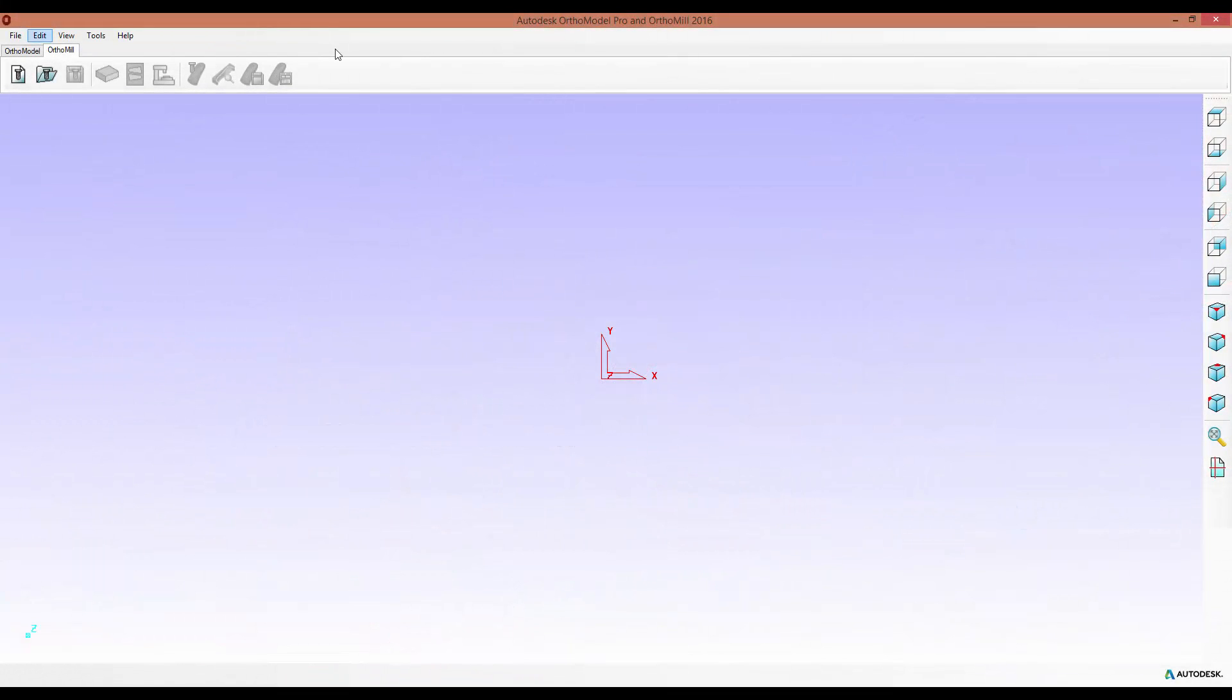Hello, and welcome to this OrthoMill 2016 New Features Guide. I'm going to be going through the changes made to Workpiece Definitions.